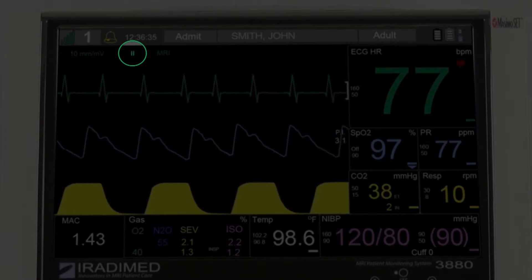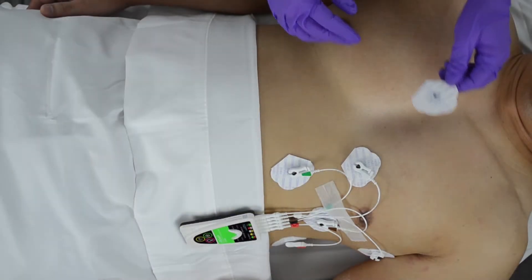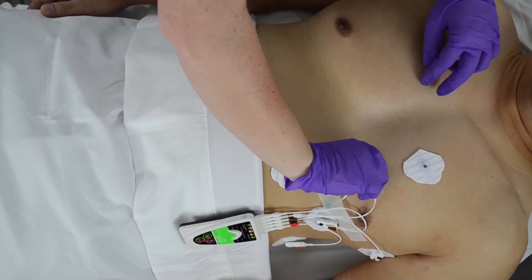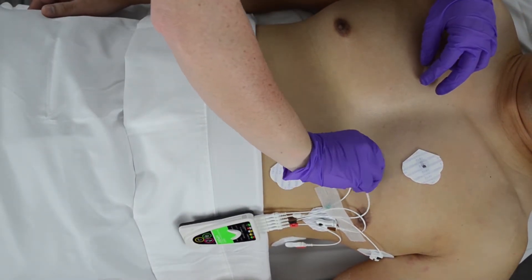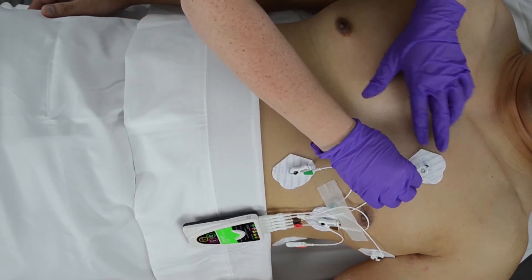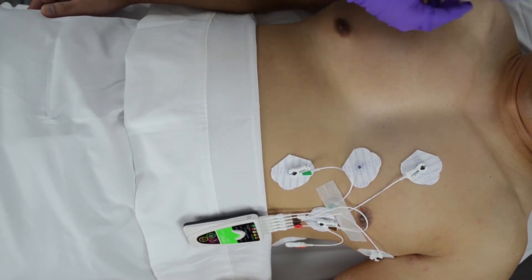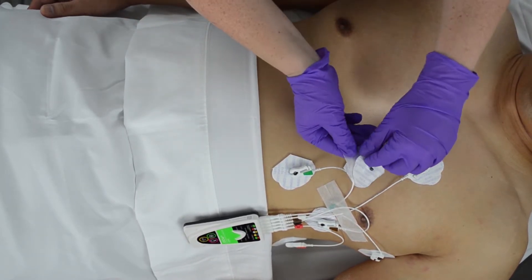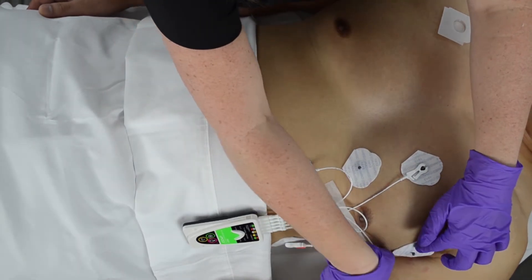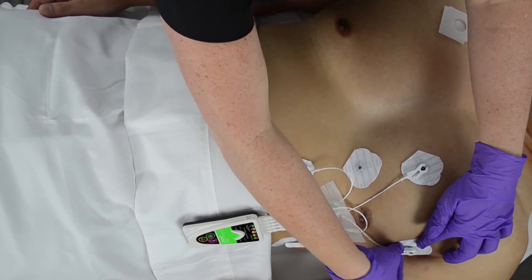If the signal is still inadequate for MRI scanning, the user will then reprep the patient's skin above the RA or R and LA or L electrodes. Take two new wet gel electrodes and place them approximately an inch above the RA or R and LA or L electrodes, then reattach the lead wires.